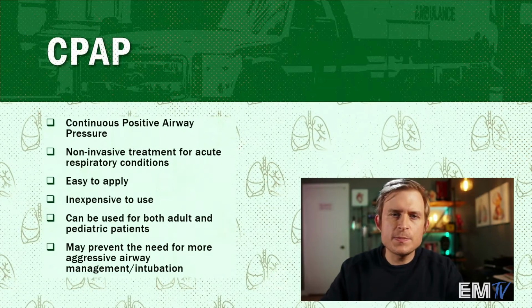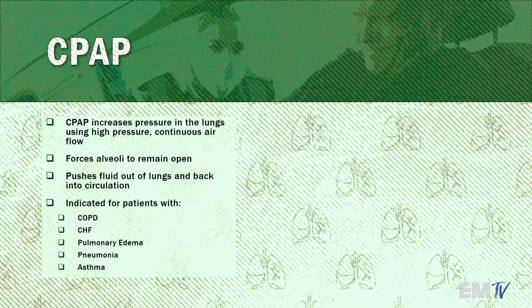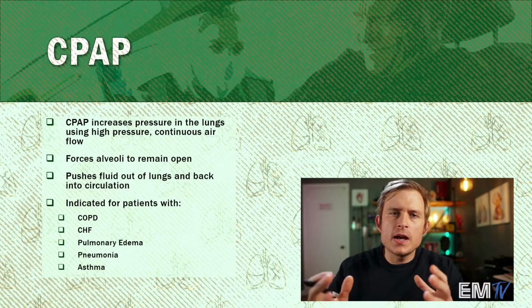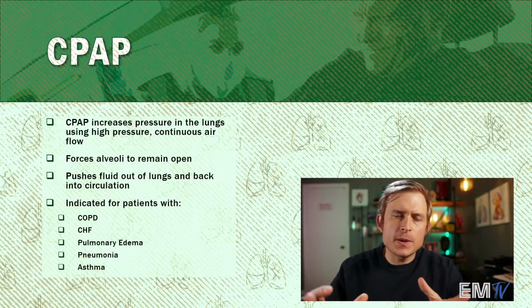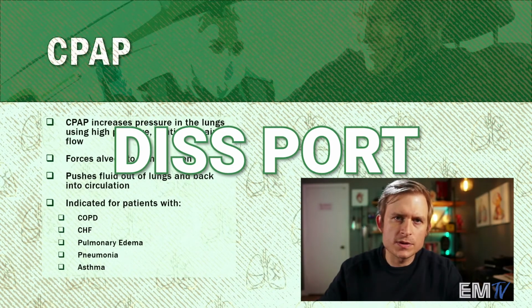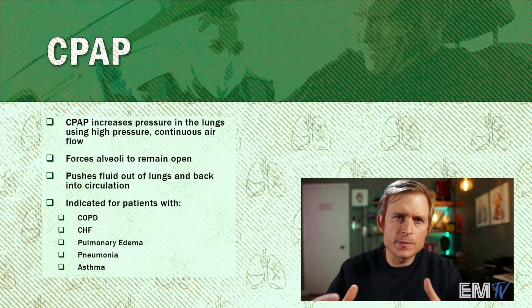And the nice thing about CPAP is it may prevent the need for some more aggressive airway management or even intubation of the patient if you use it early. CPAP works by increasing the pressure within the lungs using a high pressure continuous airflow. And what we will do is we'll actually hook up a CPAP device directly to an oxygen tank using the DISS port on the side, which bypasses the regulator. In the skills video, you'll see what I mean.